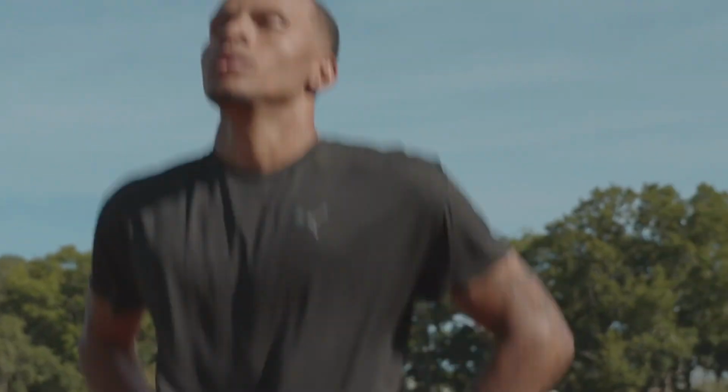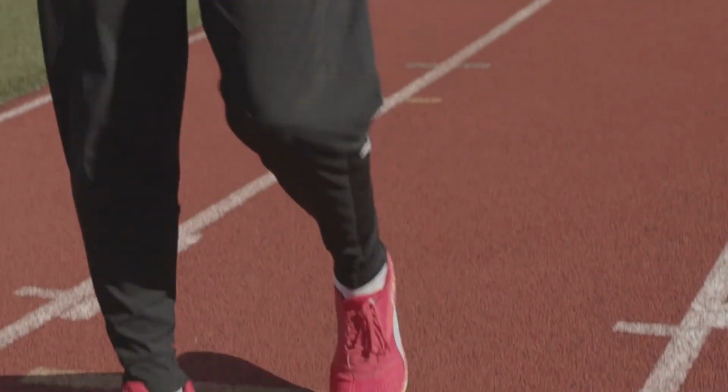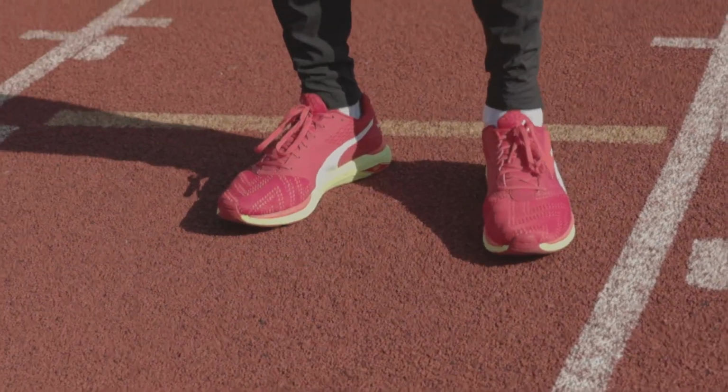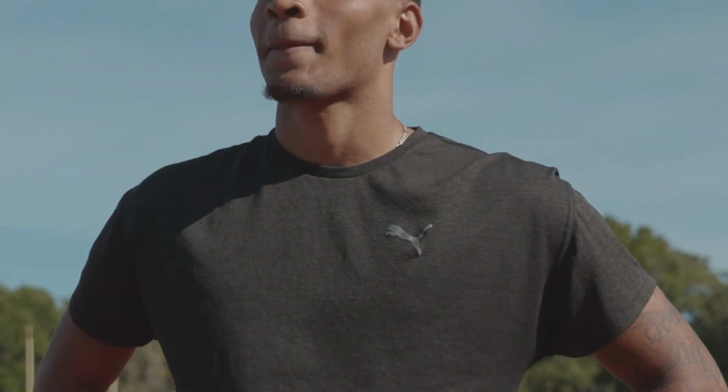To ensure a more standardized test, the athletes can keep the hands placed firmly on the hips throughout the test. Have the athlete stand quietly for 5 seconds after the test is done. That's a brief instructional overview of the walk, run, and jump test. Remember to follow the protocols closely, as the better the test is run, the more reliable data you'll have in the end.